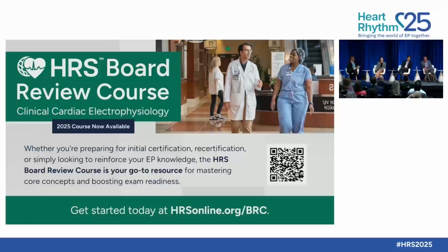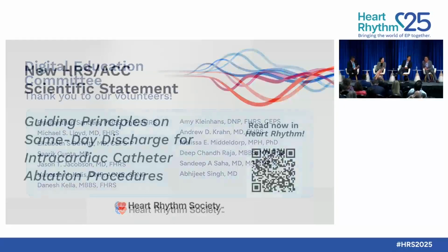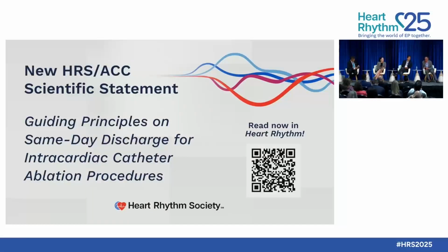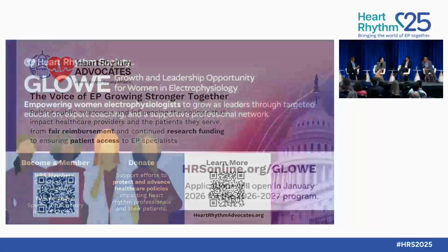And in regards to the Restart trial, something that I've learned as well is that termination and non-inducibility is important. That is an important endpoint. And I have to start moving towards that, especially for persistent, long-standing persistent, and definitely redo procedures. Because anecdotally, my patients that recurred, I didn't get to that. Restart didn't push me to keep going till you got to non-inducibility like Taylor did. I stopped after a certain period of time. I'm acknowledging that I need to continue to do more for those patients.